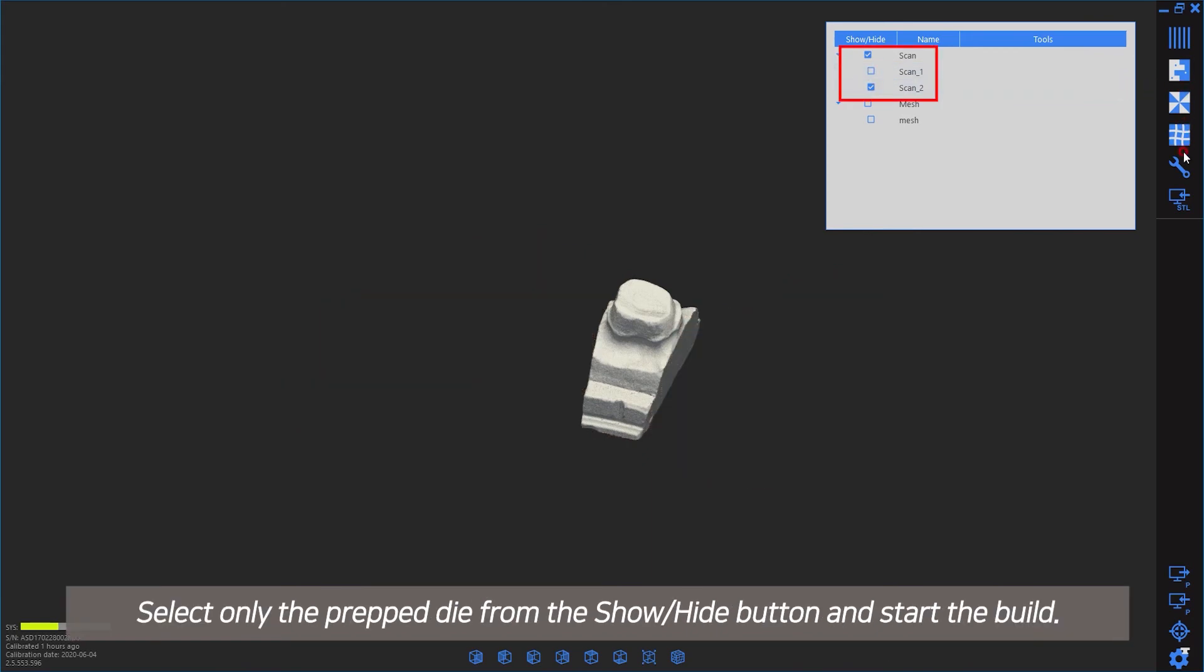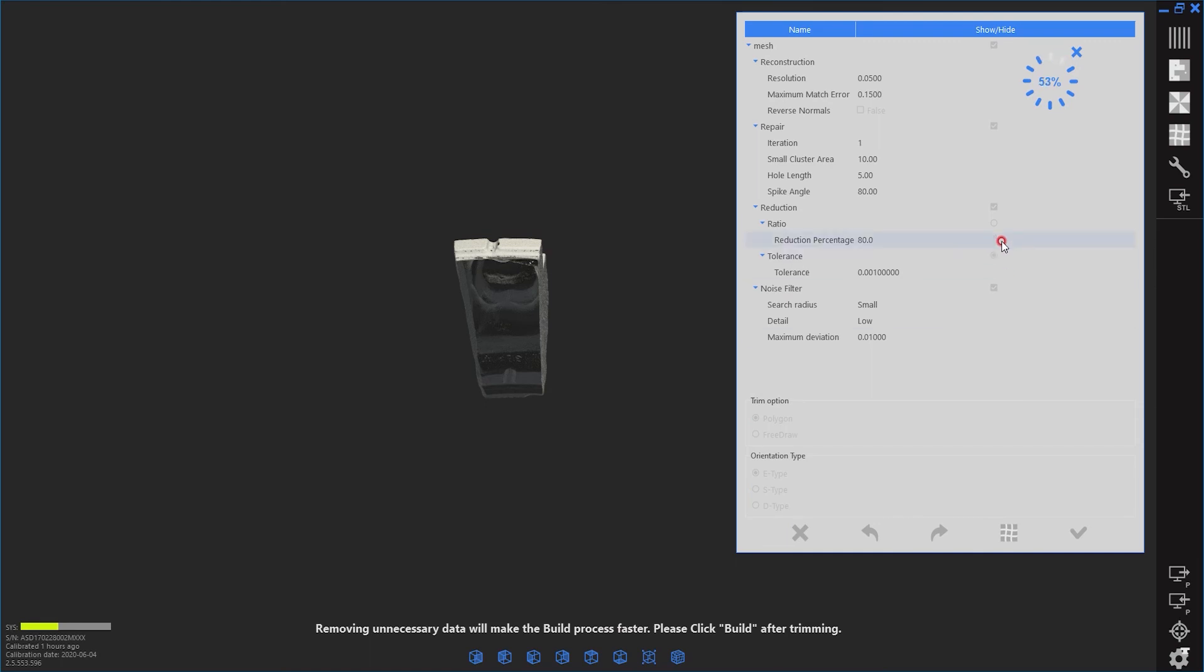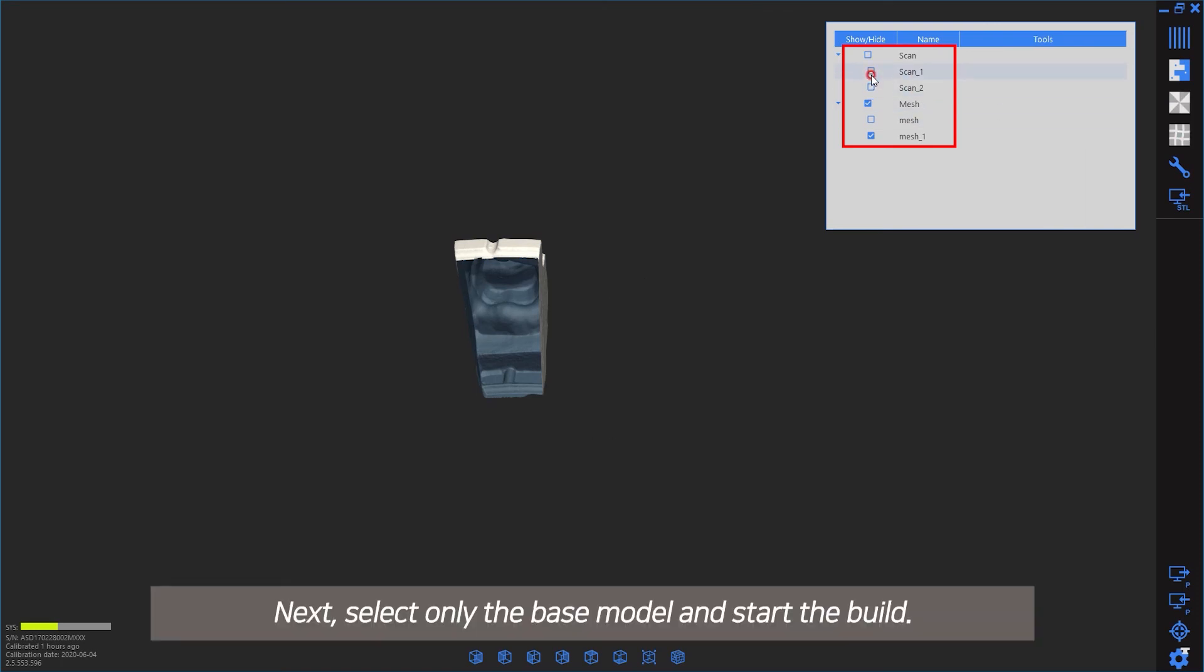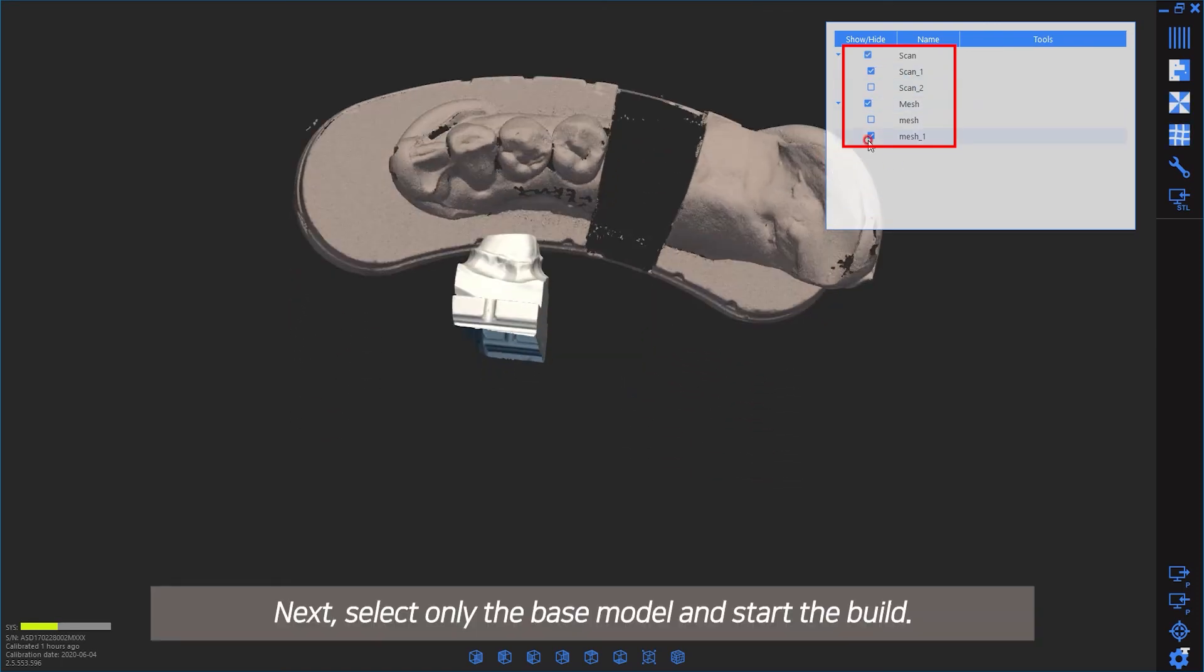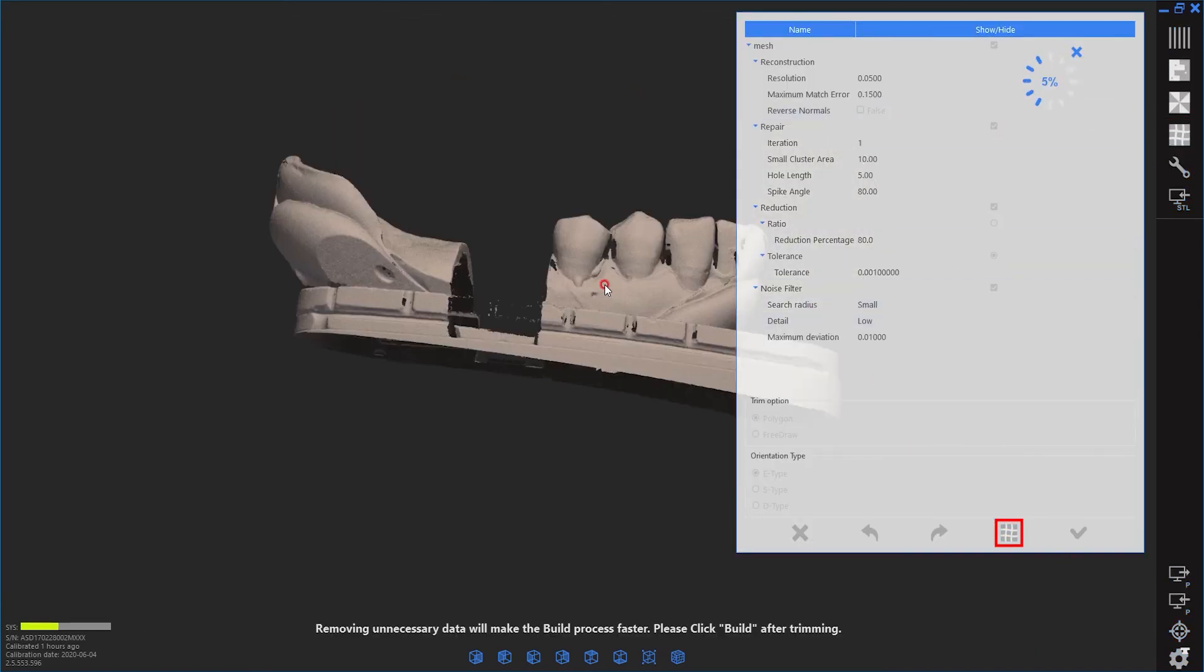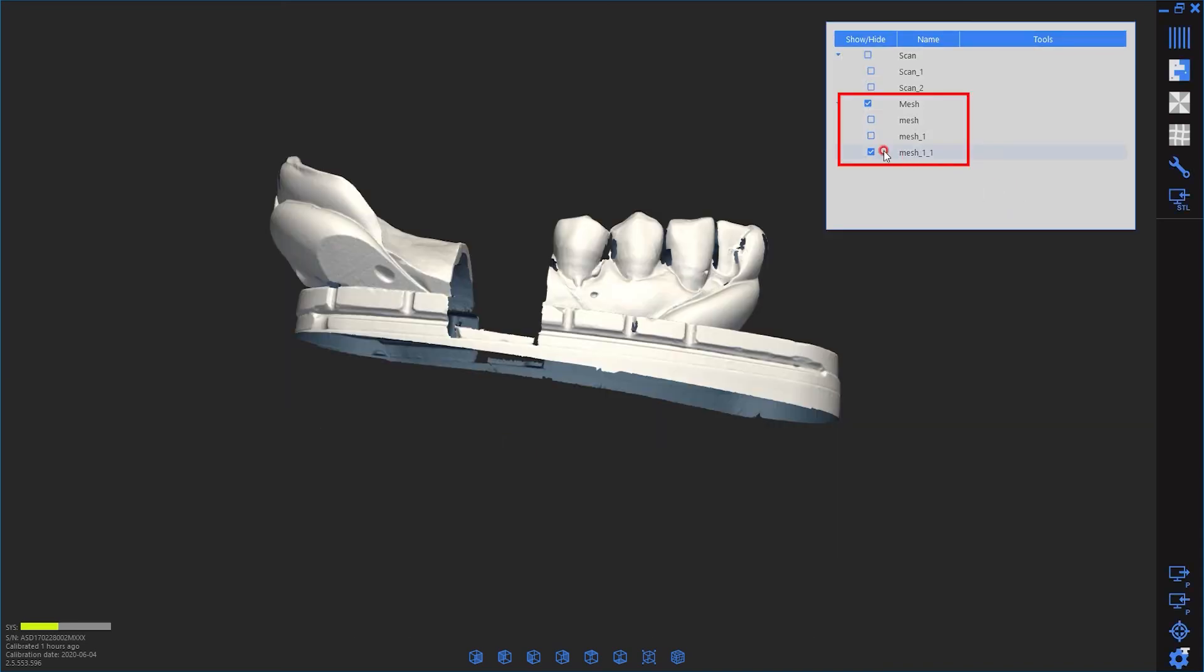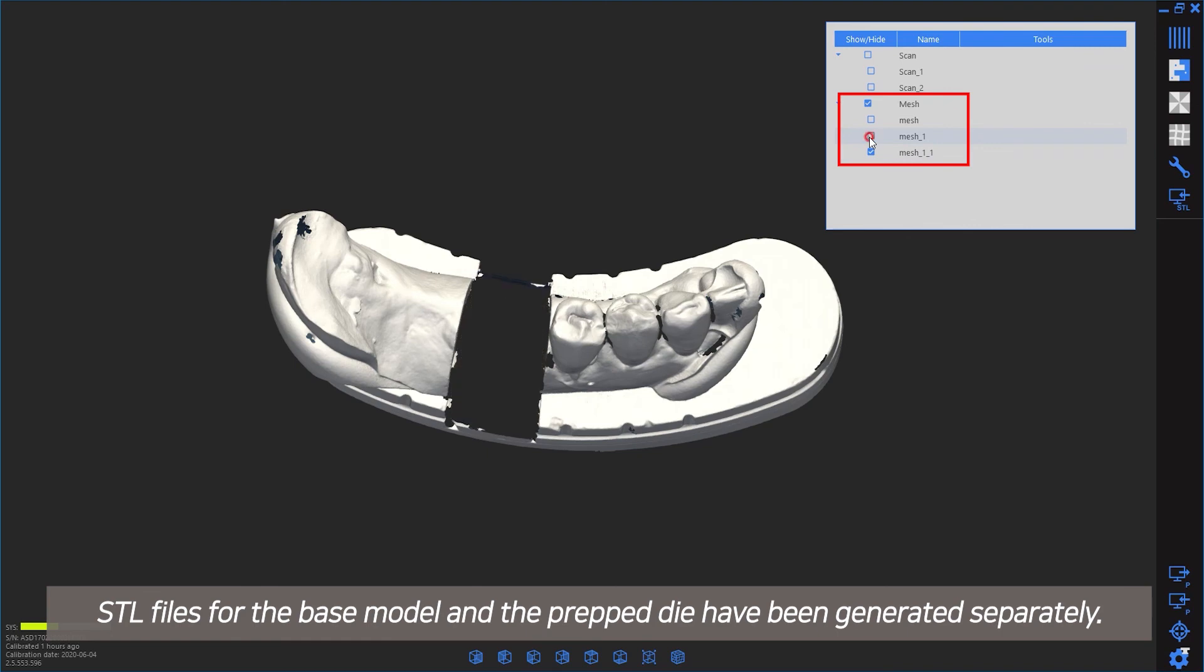Select only the prepped die from the show/hide button and start the build. Next, select only the base model and start the build. STL files for the base model and prep die have been generated separately.